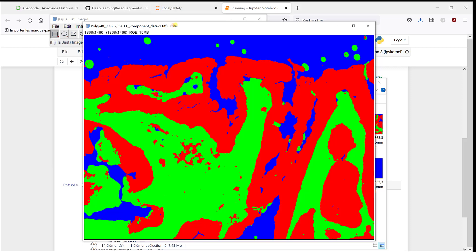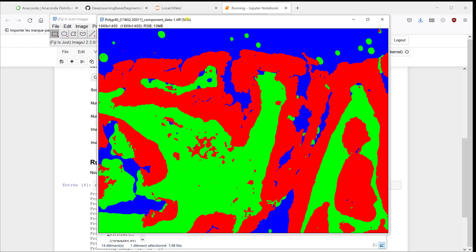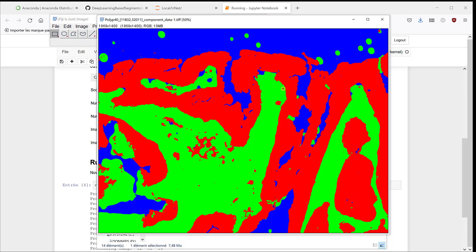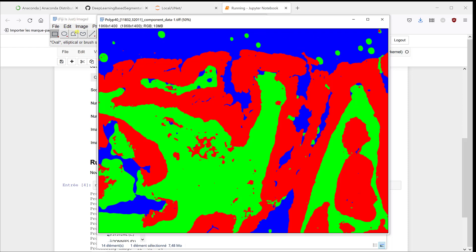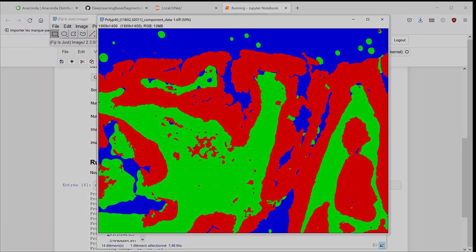So it looks pretty good. Now we could do some post-processing to, for example, remove the regions like here. There's a very small isolated epithelium area, and same thing here with background. So here we could use some post-processing to remove this. Something in this region maybe should be removed. Also, we could do some data augmentation to improve the accuracy a lot.